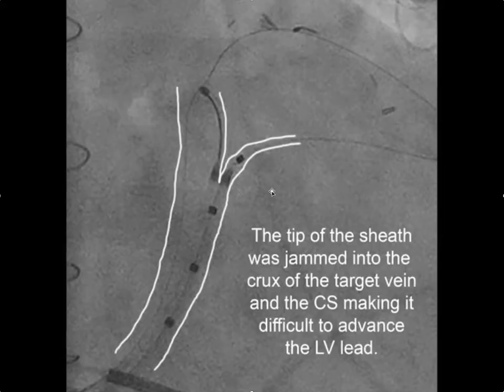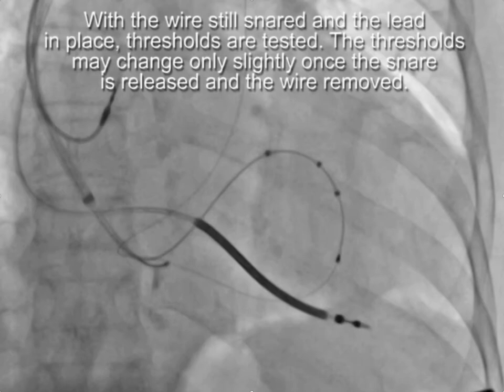Also watch out for where the sheath is located. Once you've snared the wire, it's a good idea to get the sheath out of the coronary sinus. Here, the sheath was advanced up into the coronary sinus right at the bifurcation of the target vein and the body of the coronary sinus, creating a stenosis that prevented the lead from advancing into the branch even though it was snared. Pulling it back allowed us to advance the lead.